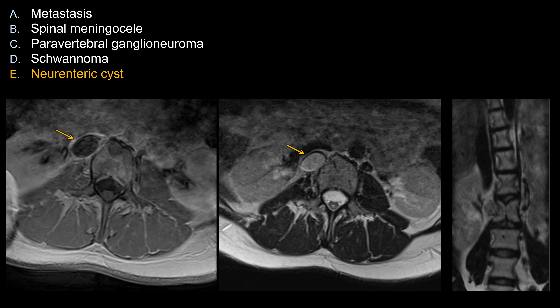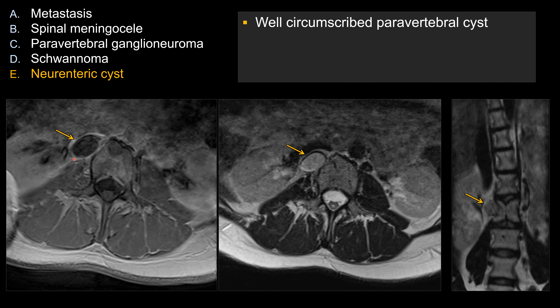The best answer here is going to be E, neuroenteric cysts. Let's look at some of the features that make choice E the best answer. There is a well-circumscribed paravertebral mass lesion. You can see that it's dark on T1 and bright on T2, so it looks quite cystic.